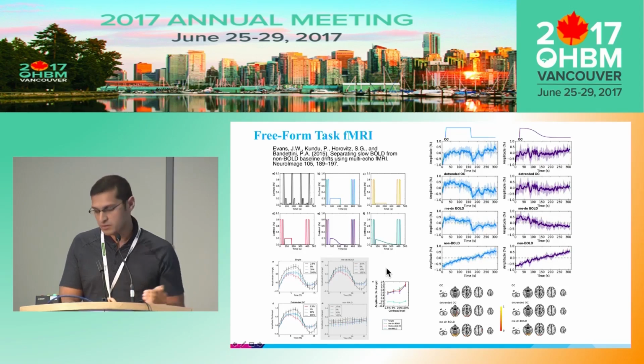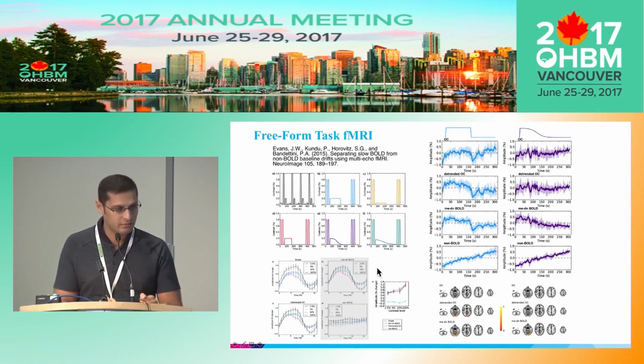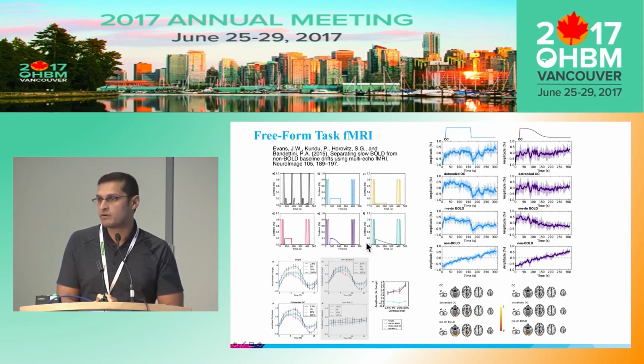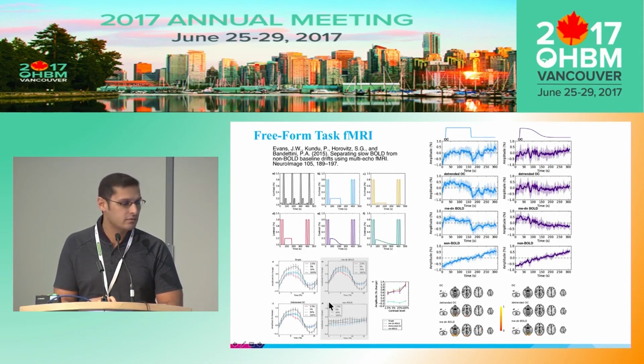Another capability is, because we don't apply any bandpass filter to the data, we can actually find activations related to a task in any design that we want. So we don't necessarily have to impose a 20-second or 10-second alternating block design. We can actually do long blocks and short blocks, sigmoids. This is really important for pharmacological studies because we don't know what the time series shape should be.